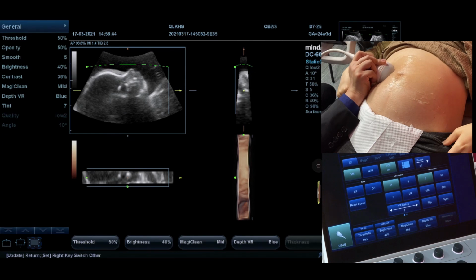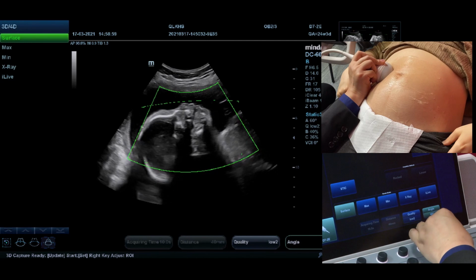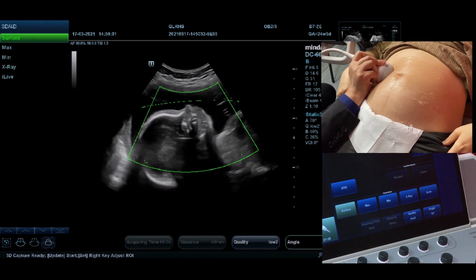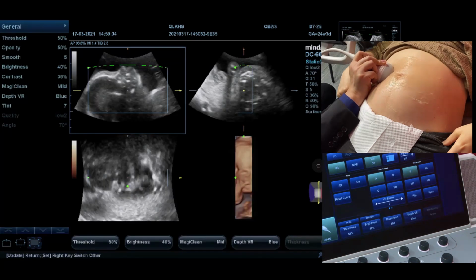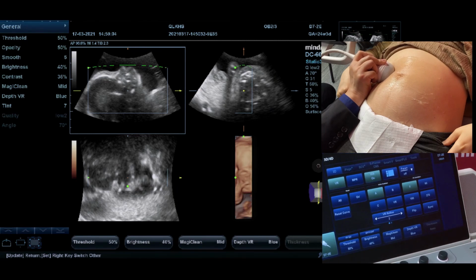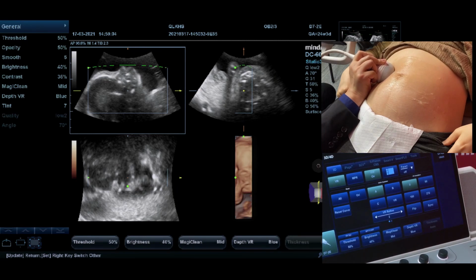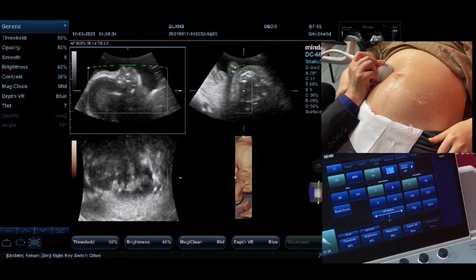And also, if I change this angle to a larger one, to 70, you can see here is also a narrow image. Maybe you're wondering why the volume angle is larger and also the box is narrow. At this time, we need to change some parameters.